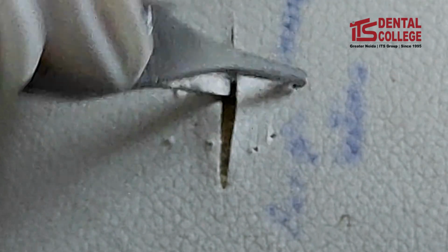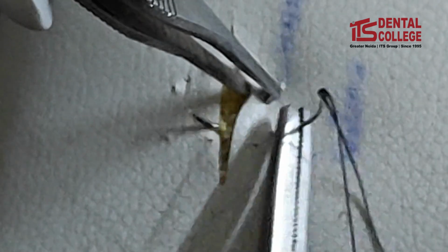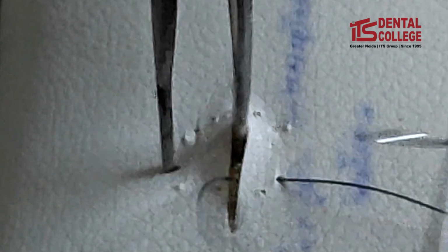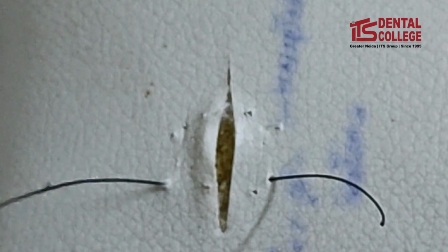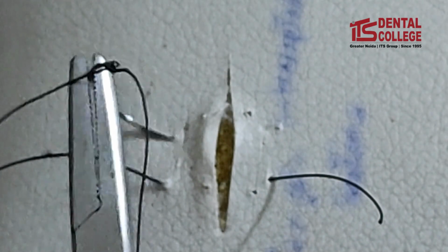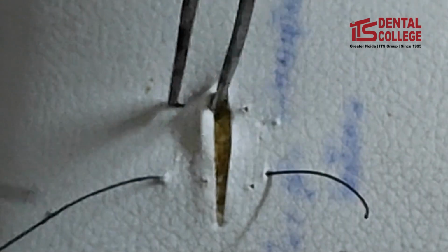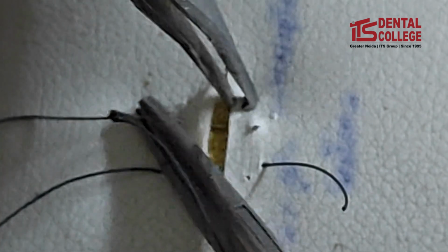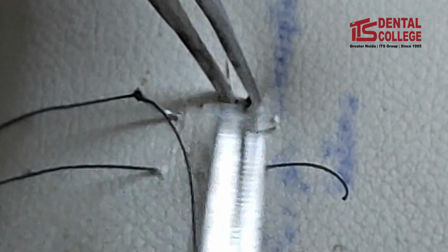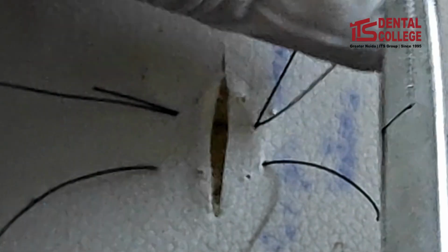Next suture is the horizontal mattress suture. So first bite will be taken from the buccal aspect. Second will be taken from the palatal or the lingual aspect. Just adjacent to the second bite, we will take our next bite, that is again on the palatal aspect. And last will be again on the buccal aspect, just adjacent to our first bite.